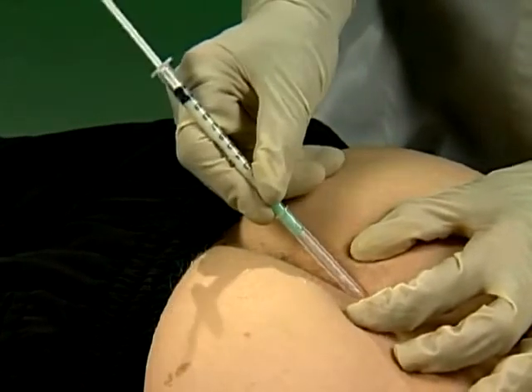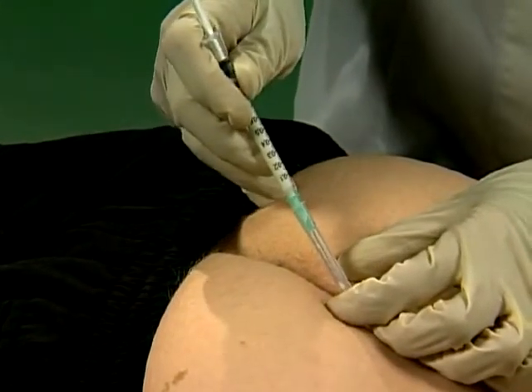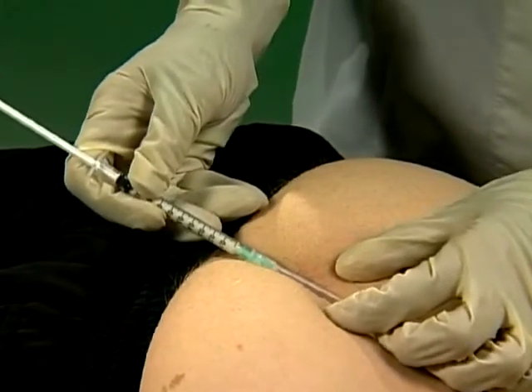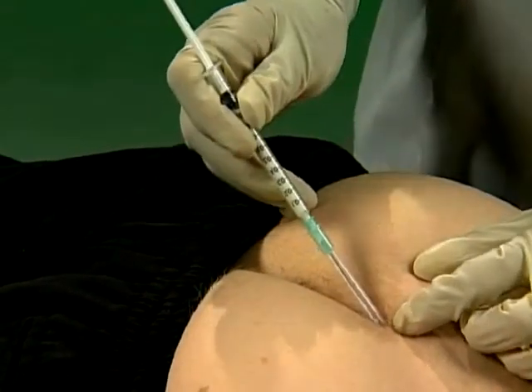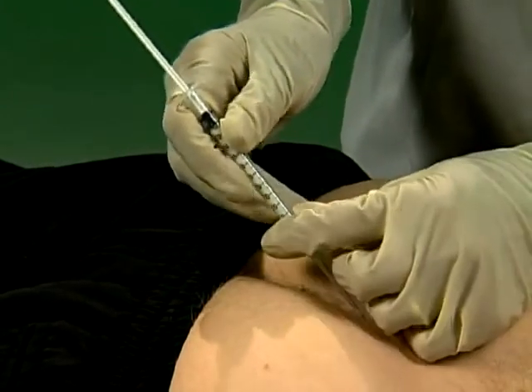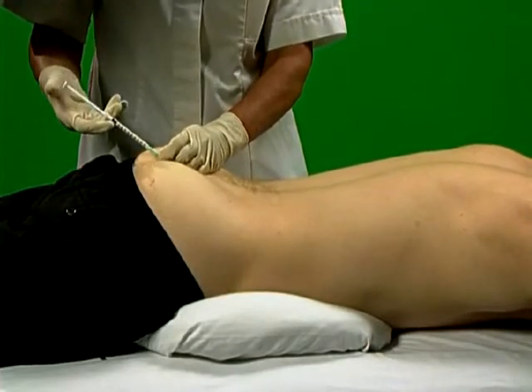Angle proximally at about 45 degrees, although this is very variable. The needle may have to be changed several times to ensure that it passes through the sacral hiatus and slides a short distance slowly into the canal. Aspirate to ensure no cerebrospinal fluid or blood is present, and then inject slowly as a bolus.